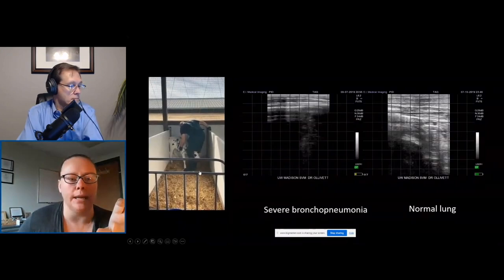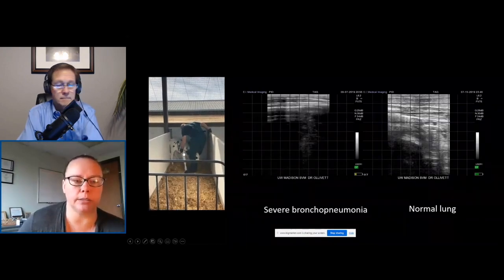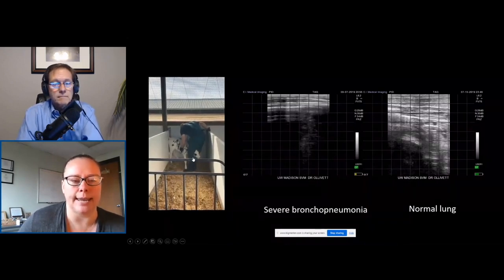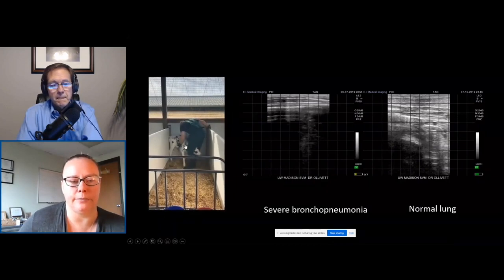And the way you're going to do that, you can see Austin's hand is on the side of the calf's chest. That right cranial lobe, the first rib space, is way up underneath that forelimb. So he's going to push his hand up underneath the triceps of that calf, up underneath the elbow, in order to see that. But he's going to watch his landmarks as he goes from rib space to rib space to be able to see that spot. Pre-weaning calves are pretty flexi-bendy, so it does take some effort to get up there.